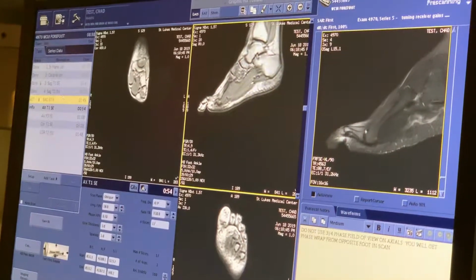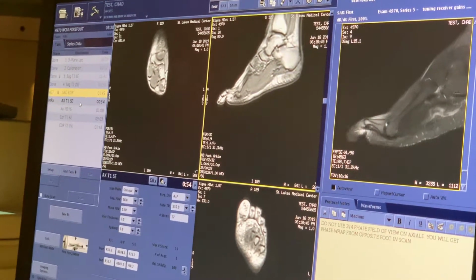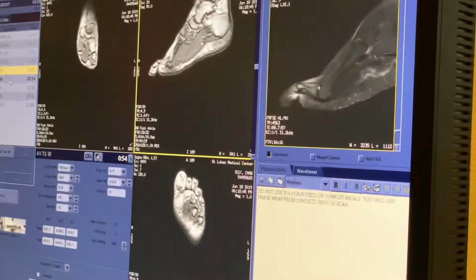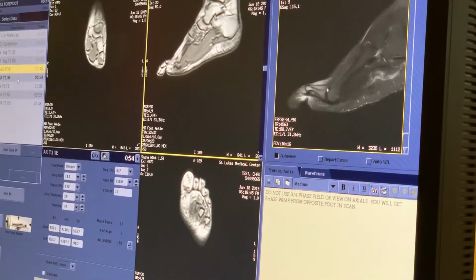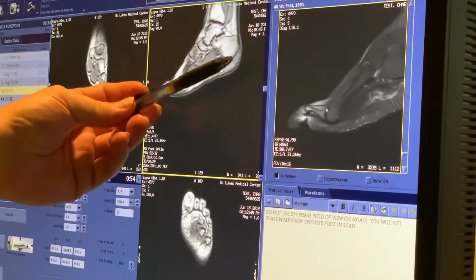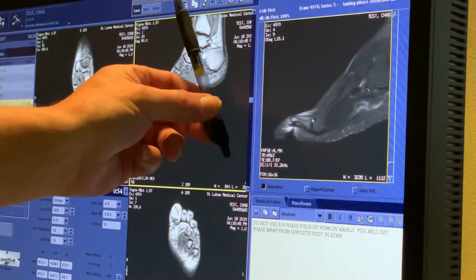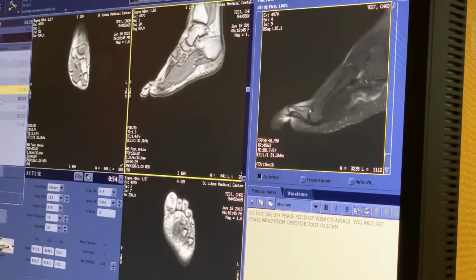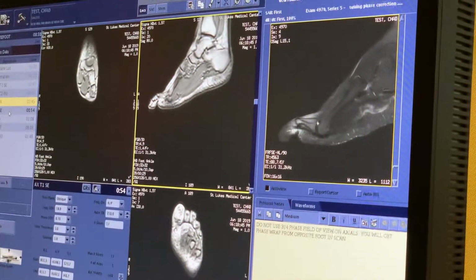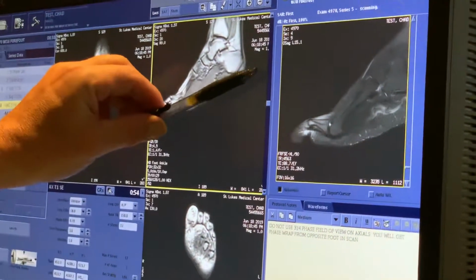All right. Now I've got to explain something about axials and coronals on feet. Axials and coronals on feet can mean 2 different things in 2 different places. There's some facilities where an axial of the foot is sliced like this. Right? This hospital, an axial of the foot is sliced like this. Some hospitals, an axial of a foot is sliced like this. Okay? And it really depends who the radiologist is, which way they decide it is. If you're at Scottsdale, wherever, an axial of the foot is like this. At this facility, an axial of the foot is like that.